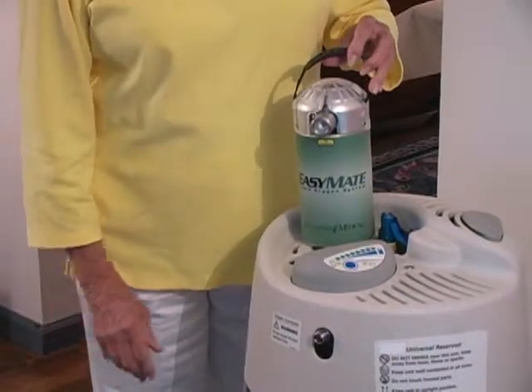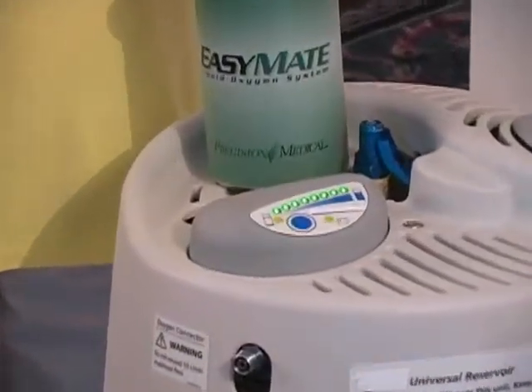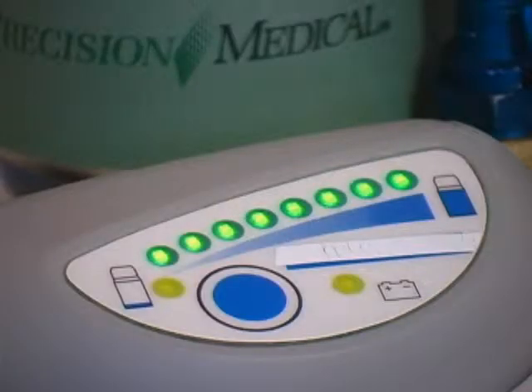Before filling your portable unit, check the contents indicator on your reservoir to be sure liquid oxygen is available. If oxygen is low, call your equipment provider.